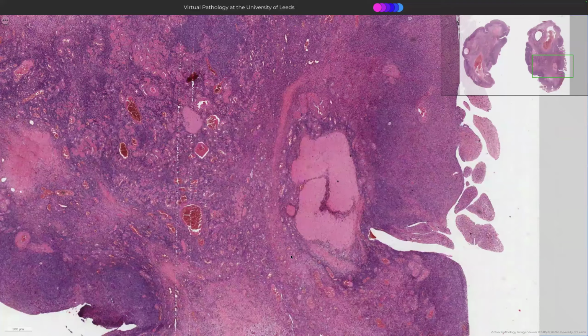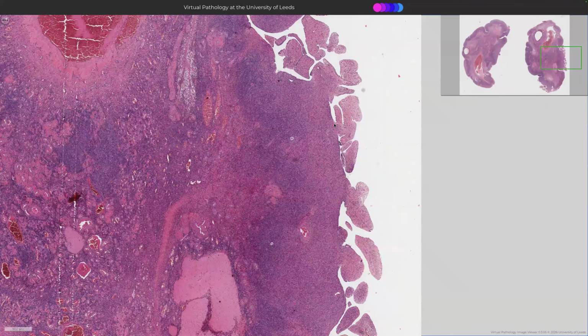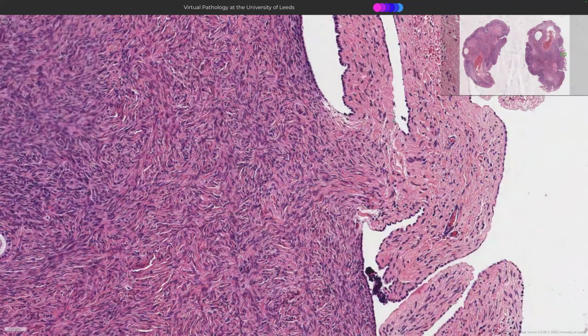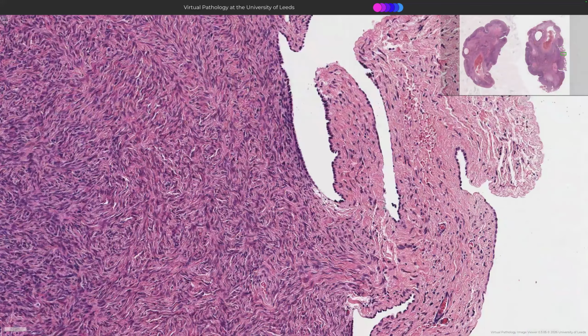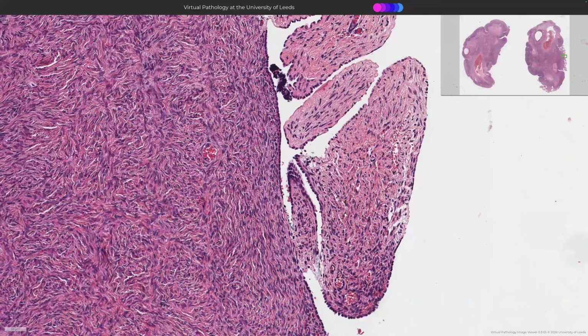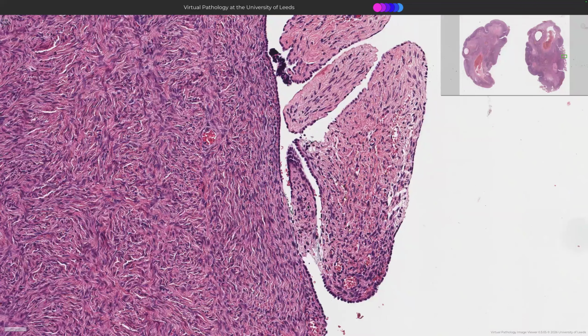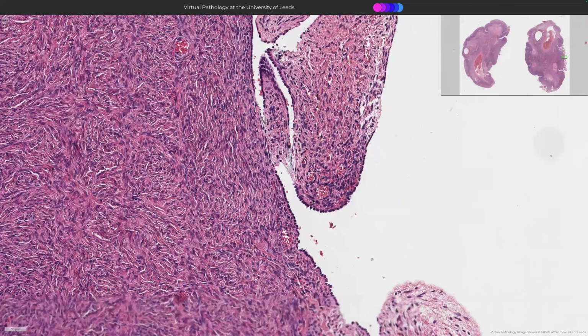Okay, now these little things on the surface of the ovary are completely normal, right? This is an unusually large amount of them, which is why I chose this slide actually. But here on the outside of them, what cells are these? What cells cover the ovaries? Yeah, mesothelial cells. Well done, Shweta.